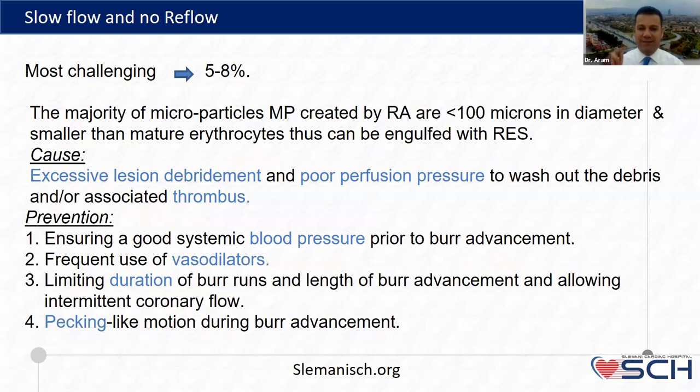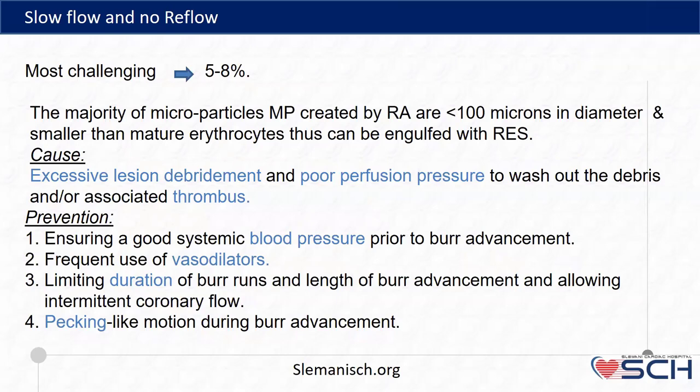We say pecking, it means in Arabic, نقر. It should be a pecking-like movement. You should go slowly and come back slowly, go slowly. No, you should have a pecking movement. These measures might protect you from complications in the form of slow flow and no-reflow.